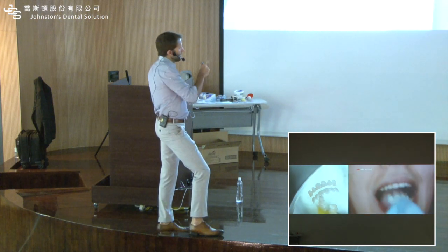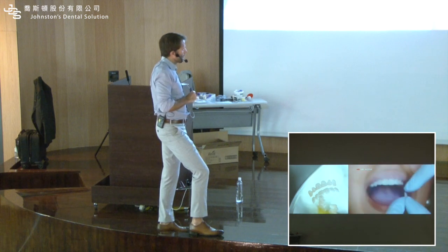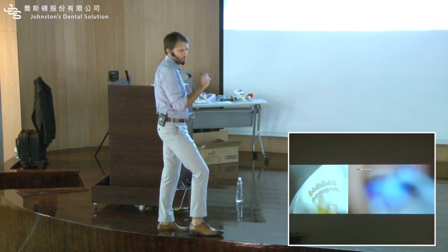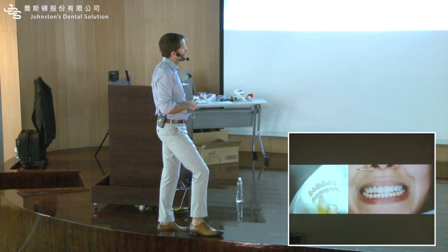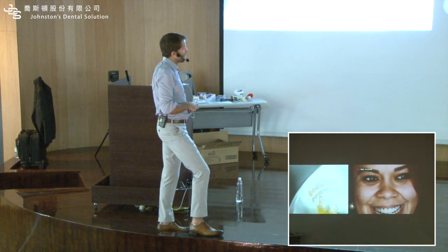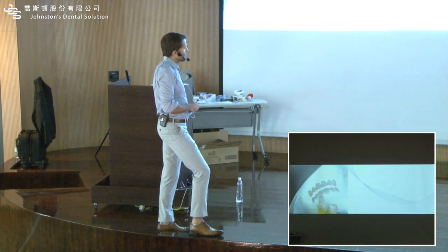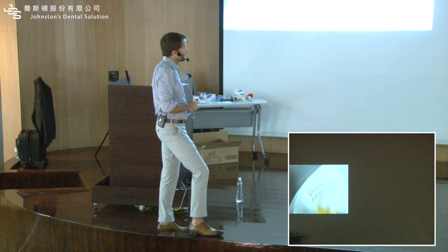Then we print. If needed, we can do a little bit of flow just to hold the shells in position. It literally takes 10 seconds. If the teeth are sticking out underneath, we can use a black marker, and you have a very nice before and after.